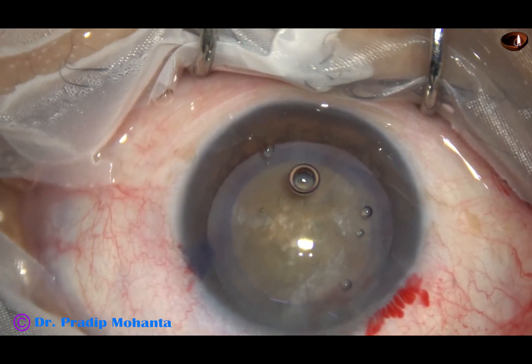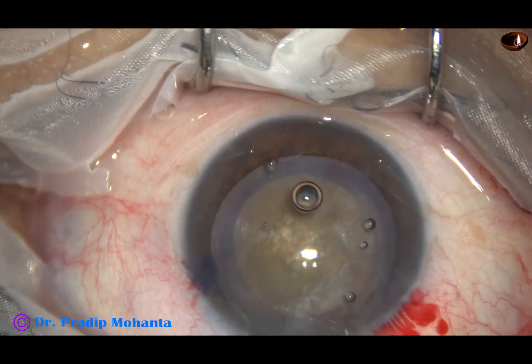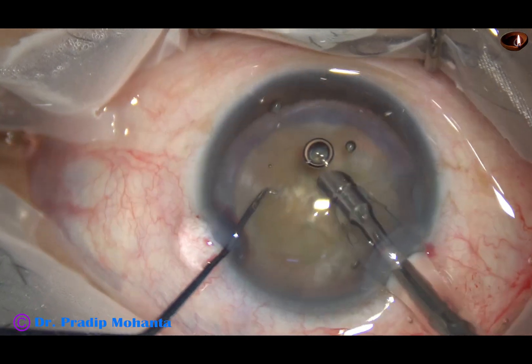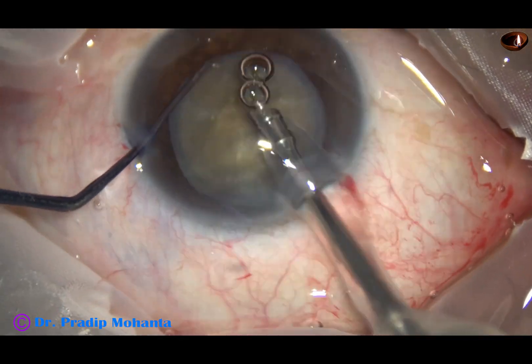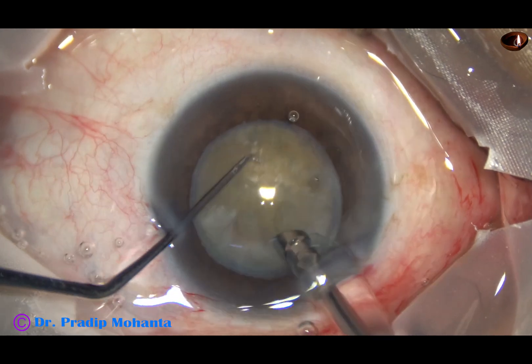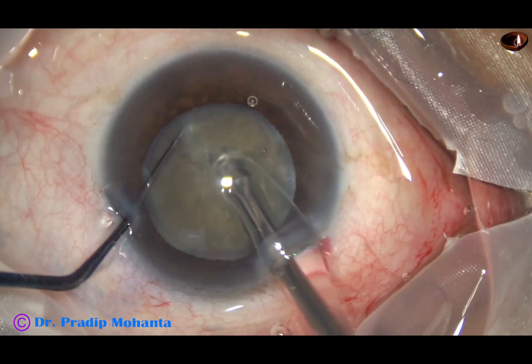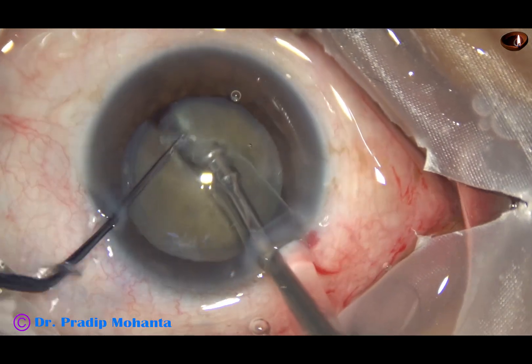Now the nucleus is to be divided into some fragments. The best and quick way to do this is to hold the nuclear mass with very high vacuum and chop it. I bury the tip into the substance of the nucleus, occlude the tip completely, and get a nice crack.